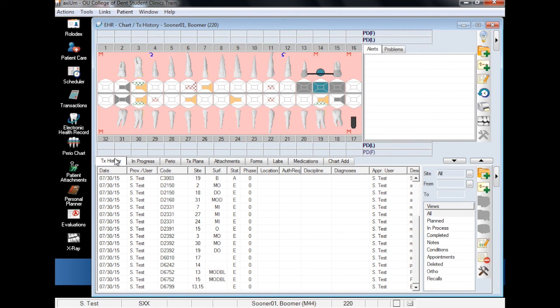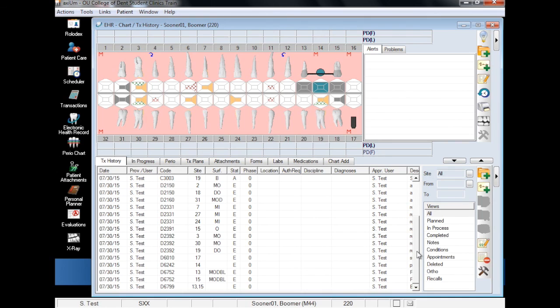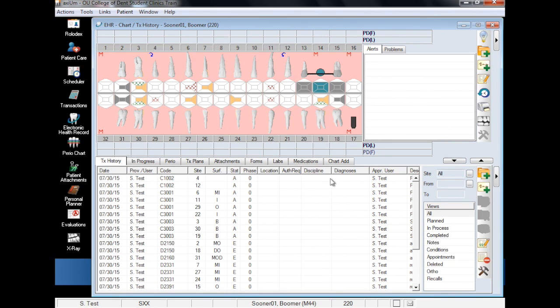When you go back to the treatment history, you will see that all of your findings have been recorded. In the treatment history tab, existing restorations and conditions are marked with a status of E, while diseases and abnormalities are marked with a status of A.